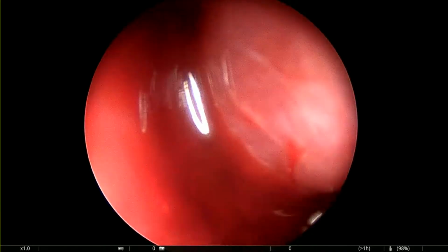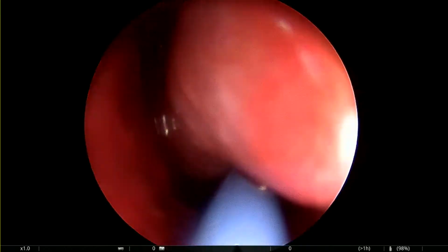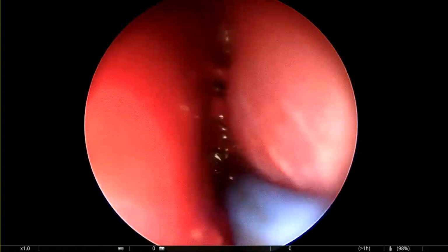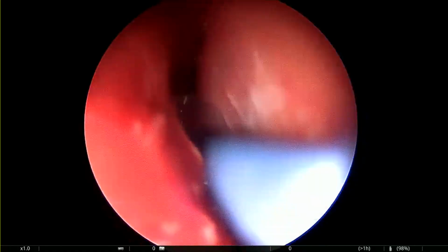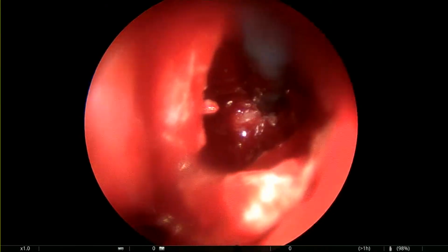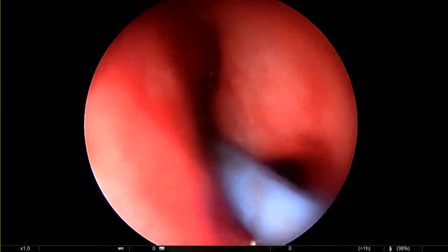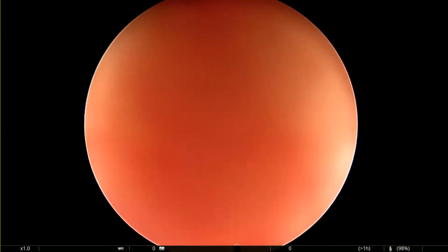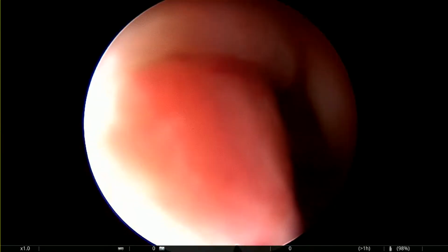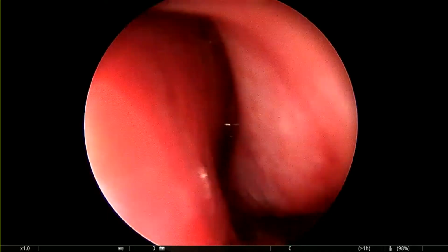Okay, it's filled, yes. So, during this time, I take this. Okay. So you have some hematoma, of course, due to the bleeding. So we continue to wash. Control the depth of this sinus. And very good.